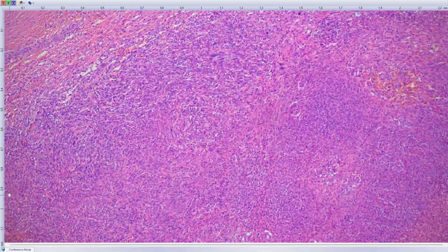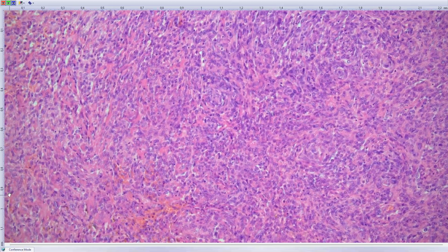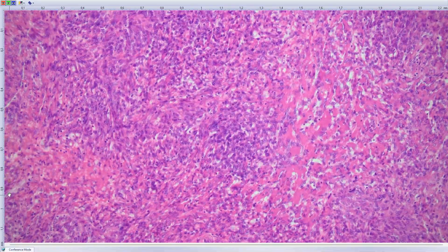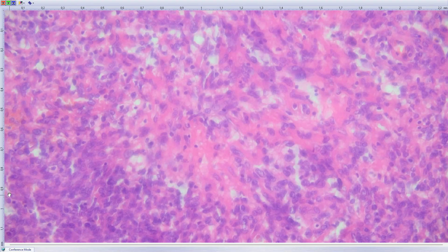And then you have here this hypercellular tumor. And what is important, you also have here this kind of cavernous space filled with blood. If you go on higher power, the tumor cells, some of them at least, have these epithelioid characteristic nuclear features. Sometimes you have to look for them, but whenever I see lymphoid aggregates at the periphery and some blood-filled spaces, I go for it. Perhaps here, these clear looking or optically empty nuclei with histiocytoid features.